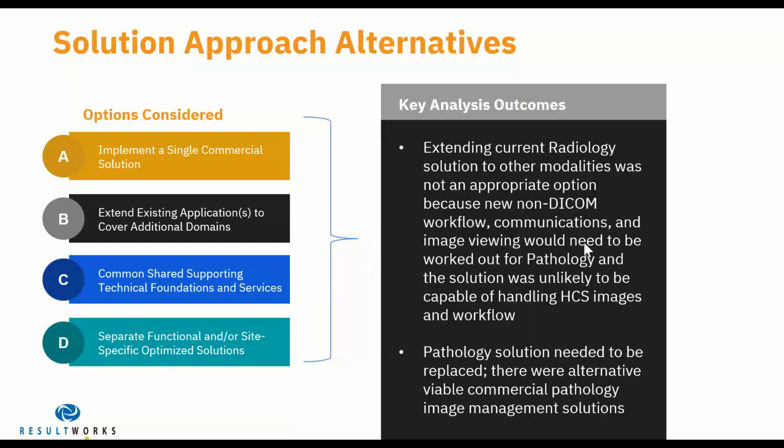We looked at the possibility of extending the current radiology solution because that was the one that was at least working in the clinical space pretty well, it just needed to be scaled into a cloud-based environment. But we found that extending that to the non-DICOM oriented workflows, communications, and image viewing that would be needed for pathology, for example, was not going to be easy to get to.